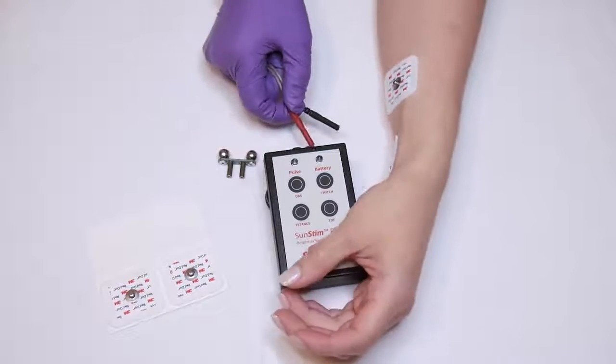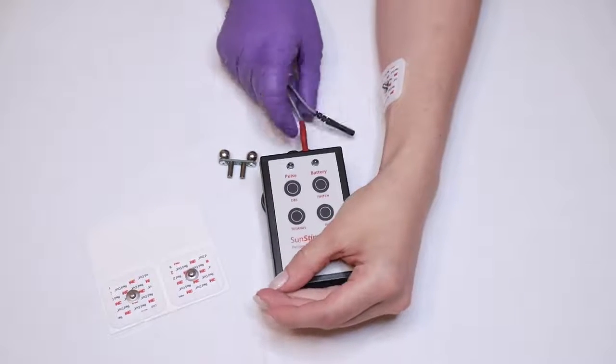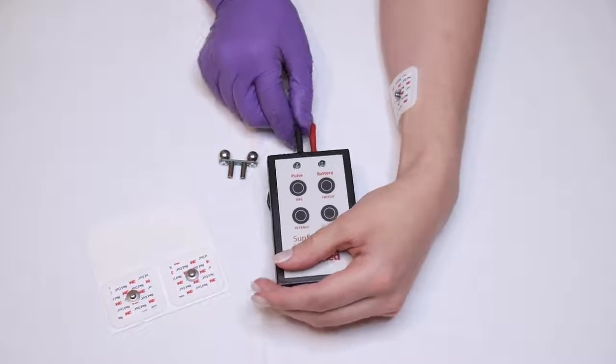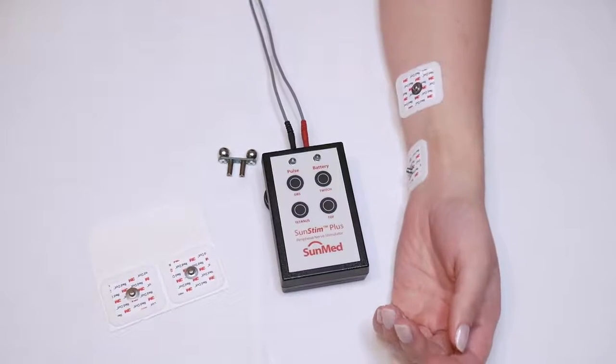Attach the lead wires when the SunStim unit is turned off. Red is your positive connection — this will be your proximal lead. Black is negative, and this will be your distal lead.